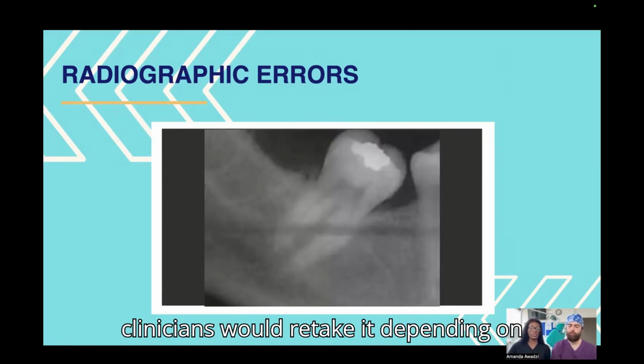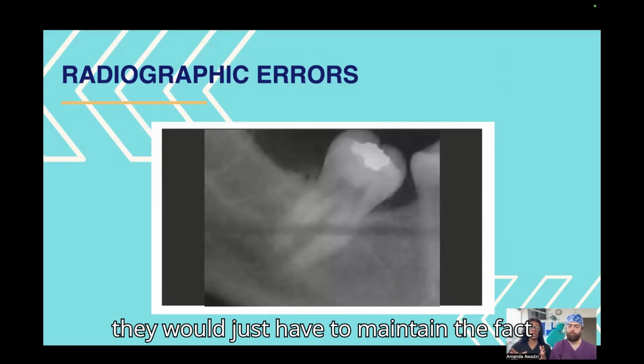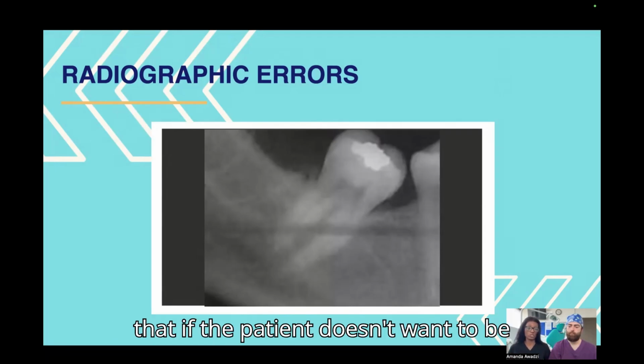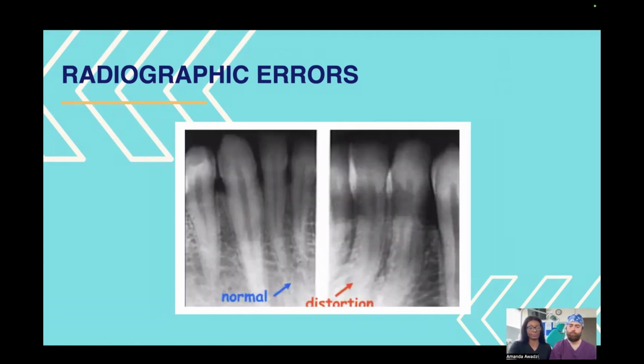In some cases, some clinicians would retake it depending on what they're trying to do. If not, then they would just have to maintain the fact that if the patient doesn't want to be exposed to radiation, unless they absolutely need it clinically, then they could attempt to retake that again.